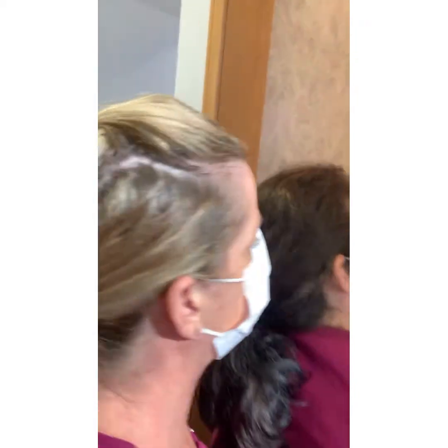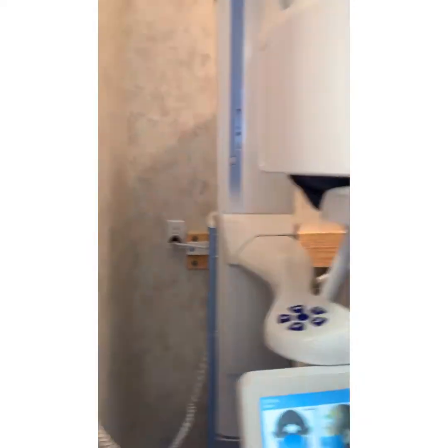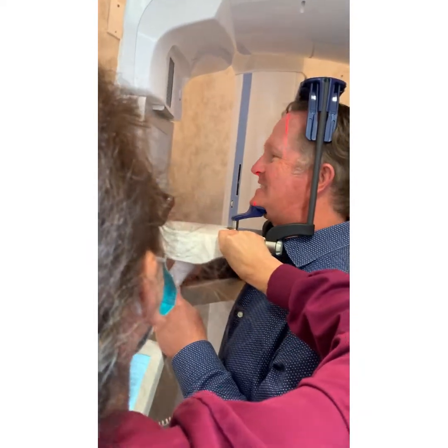You can look at it from here, but you can't tell from over there. You have to be... Oh, I can see it. Yeah, okay. You're like this far in front of 8-9. If you look from where you were standing, you're going to see this light right here. This has nothing to do with it. It has to be this light being in front of 8-9.